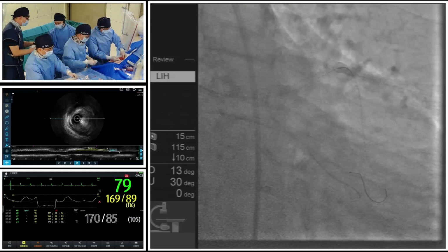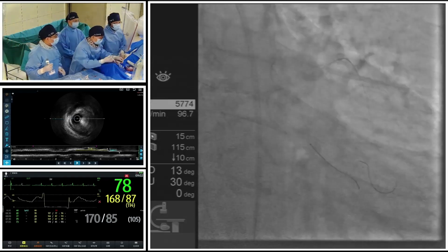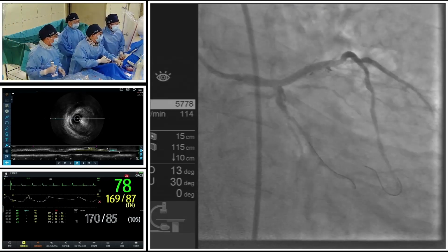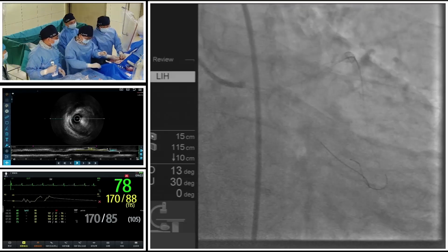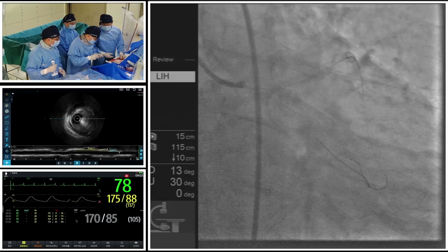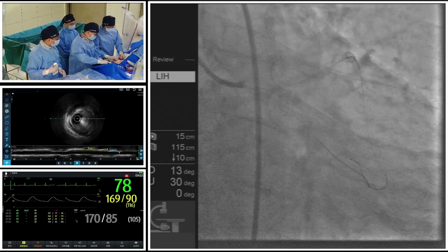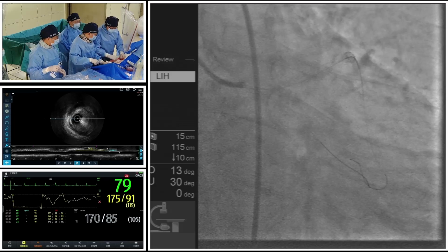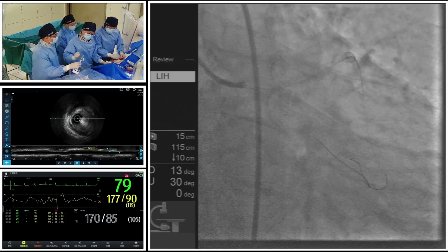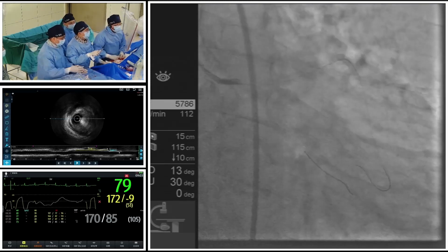So with normal heart function, the detailed information from the CT angiography, and the full usage of debulking strategies like rotablation and IVL, we can make a good modification of the plaque to maintain all the big side branches and the blood flow of the big vessels. So this is the whole idea of this case.